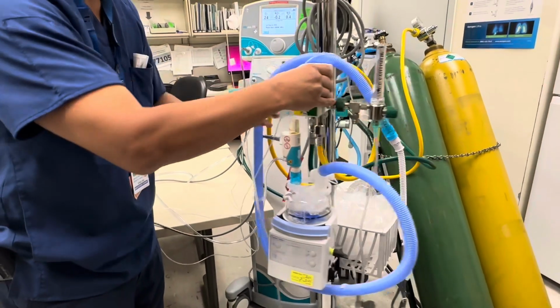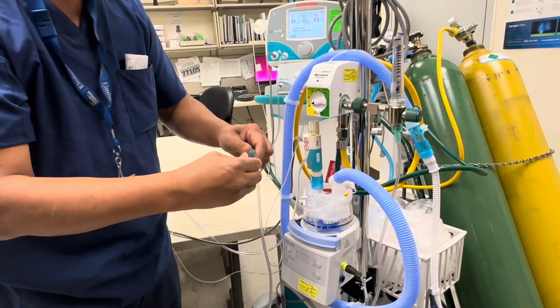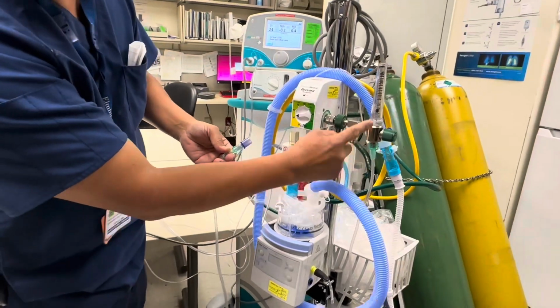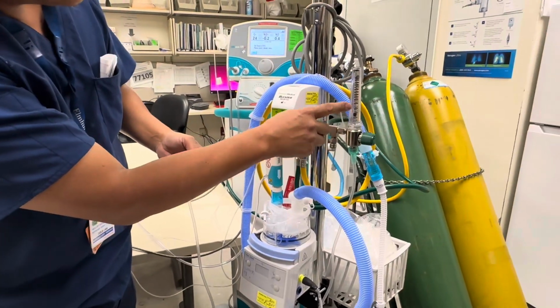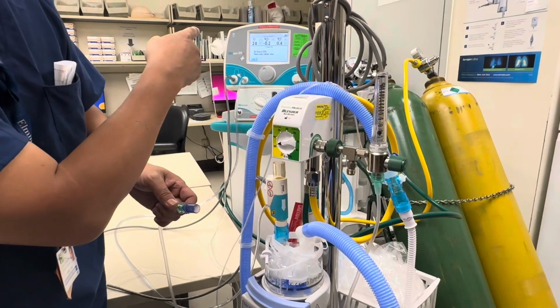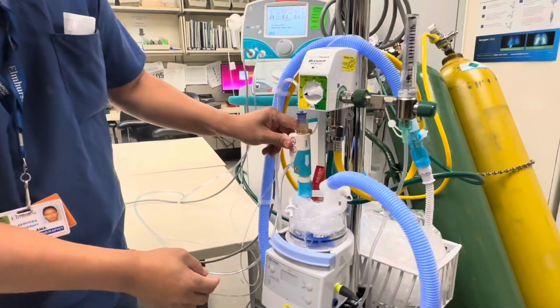Then you need this port right here for the nitric. The tubing goes here. The tubing goes to the oxygen. We have it at 2, but I think 2 to 6 is okay. You want to have some flow to make sure you get the nitric oxide to reach 5. And that goes over here, and that's it.